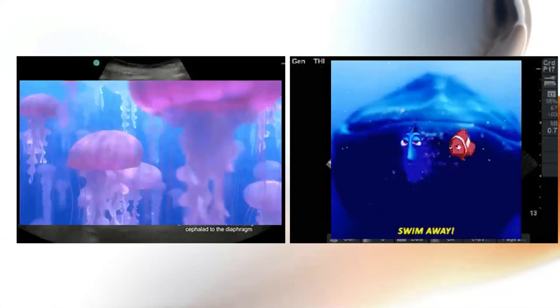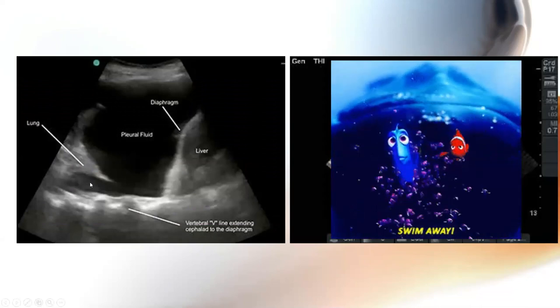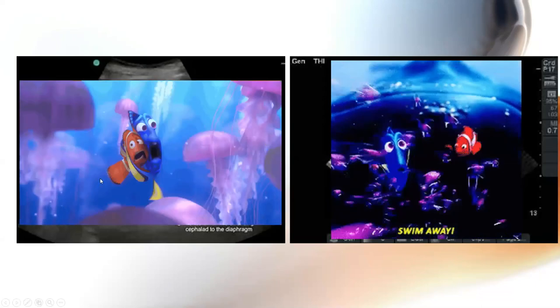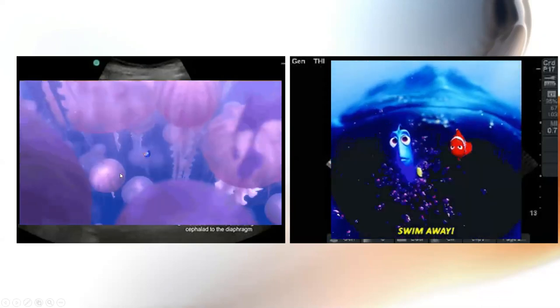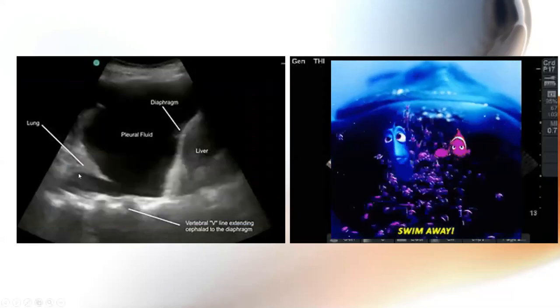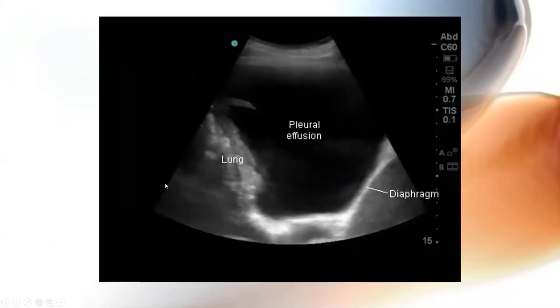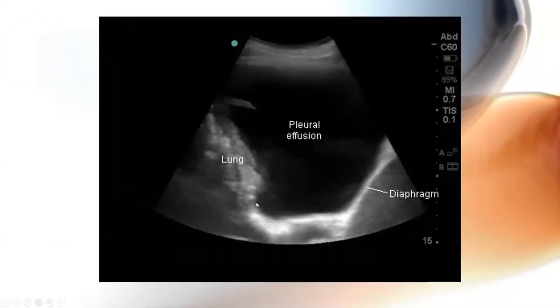I don't know why I put the jellyfish. Oh, I remember why I put the jellyfish. I keep referring to this as Bruce's tail. In lung ultrasound literature, they call it the jellyfish sign. I don't know why, because to me, it looks like Bruce's tail and not jellyfish. But if you see jellyfish sign, you're like, man, Dr. Z didn't talk about jellyfish at all. There's your picture of jellyfish, because somebody thinks that that looks like a jellyfish. All right, moving on. I just hope these are all images that you will acquire and send to me because lung ultrasound is fun.